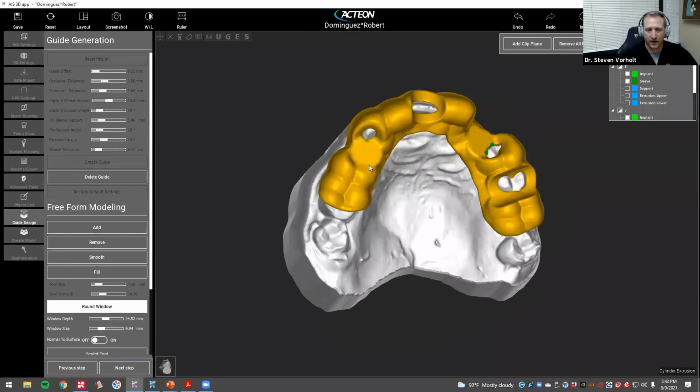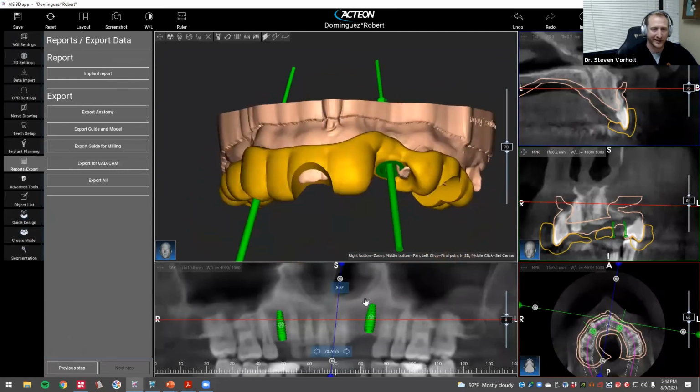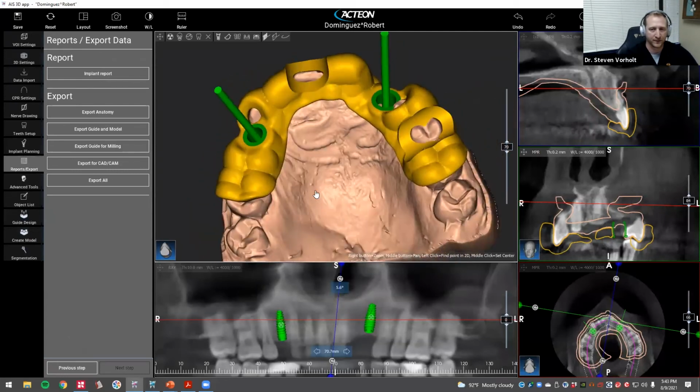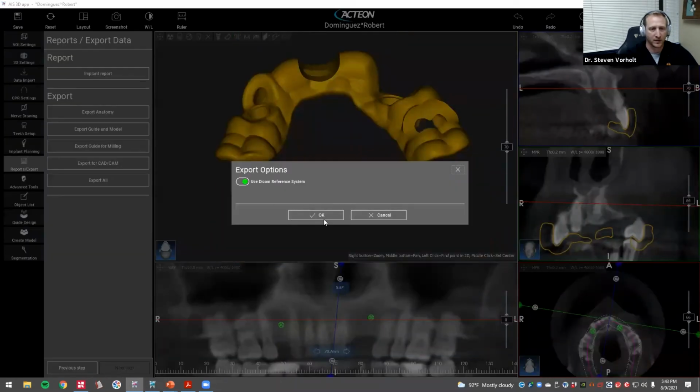And next is now going to extrude those sleeves. It's going to put holes in my guide. So here's our final guide design with our windows and our sleeves. And all I have to do is export the guide. It's going to say, okay, where do you want to put it? It's going to be a digital file. It's going to ask what part of your Windows Explorer you want to take this to. Put it on your desktop or your Dropbox or in your special patient folder, wherever you want.